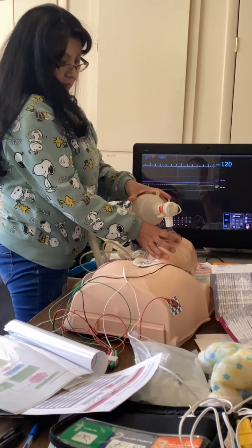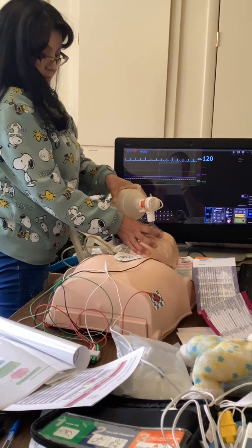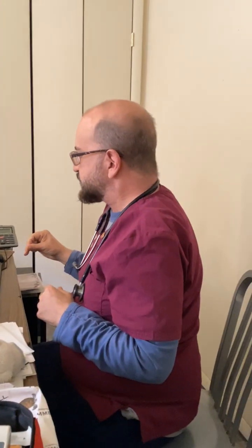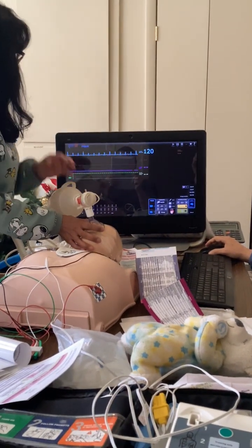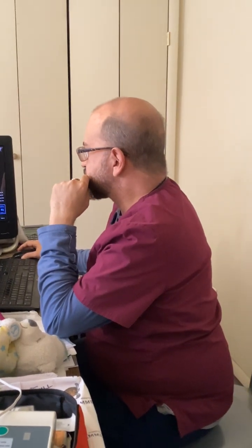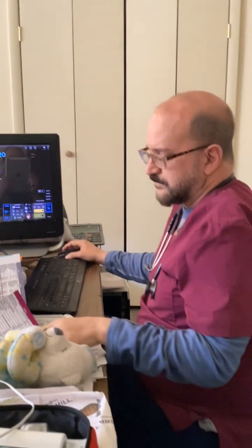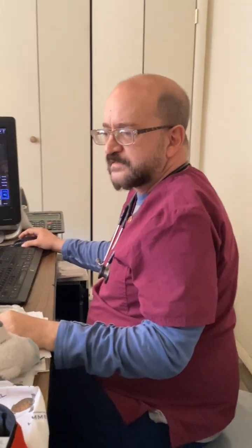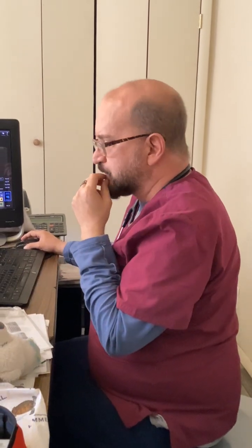Then I would get post lab work, electrolytes, especially blood glucose, chest x-rays perhaps. Okay, so let's go on to pulseless VTAC and VFib. So get your algorithm out for pulseless VTAC and VFib.